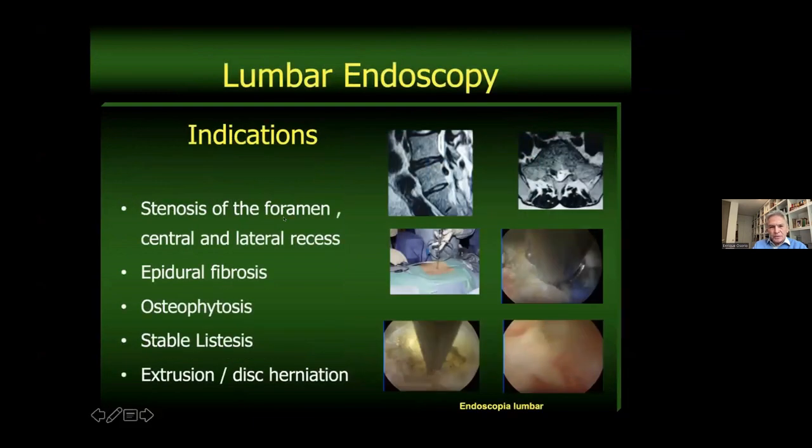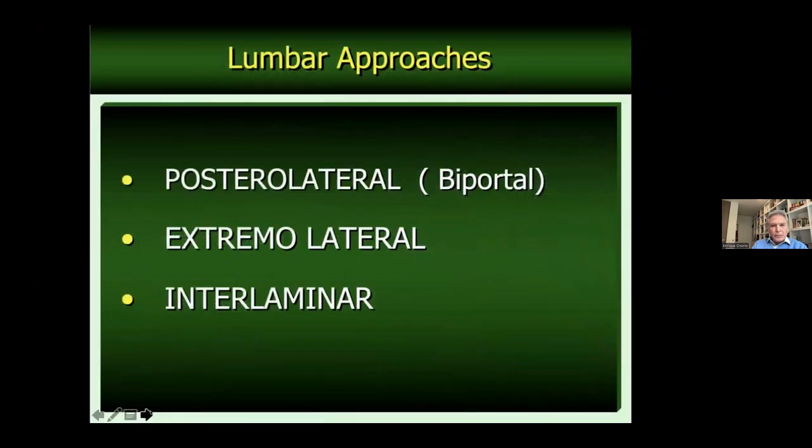The indications, as you say, there are many, but for this case, the extrusion and these herniations. And we have these approaches: posterolateral, we can do uni or biportal, and extremolateral and interlaminar approaches.